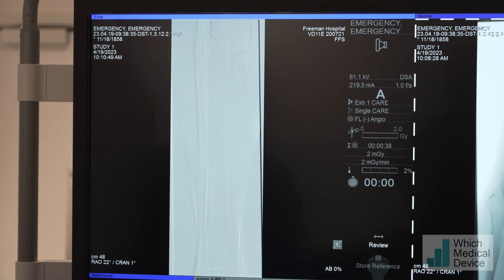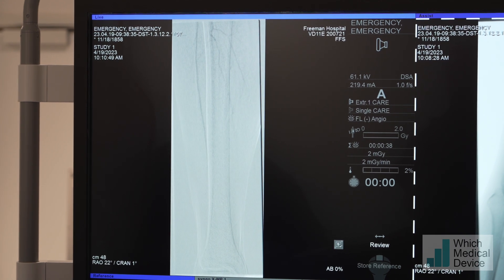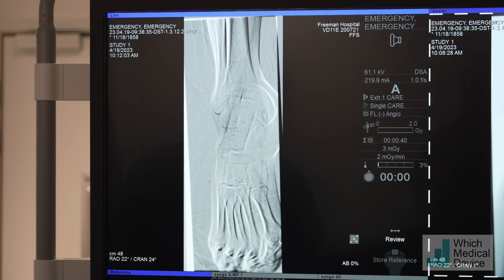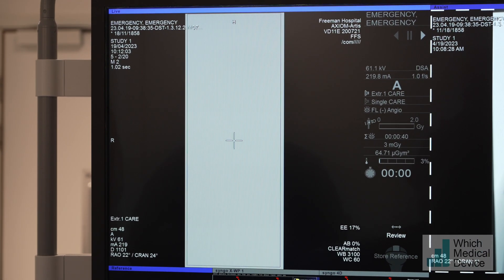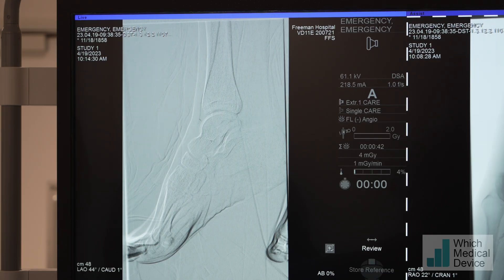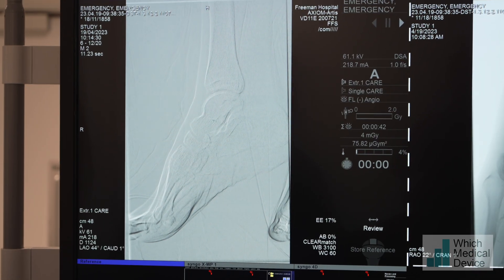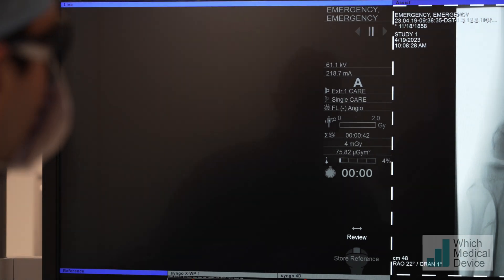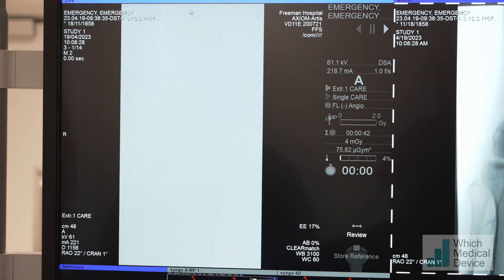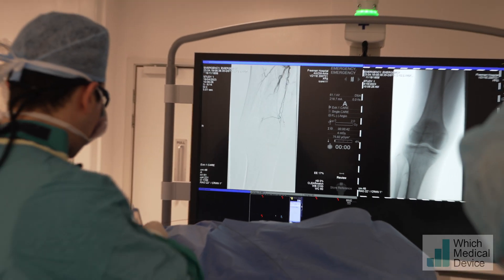We need to see what the runoff looks like - there's something but it's very hard to see to be honest. There's the anterior tibial. Shall we go back up to the run we had? Number three please, thank you. Can we get some heparin as well?